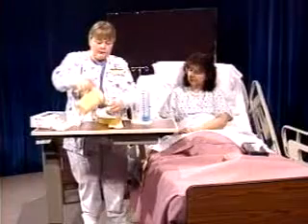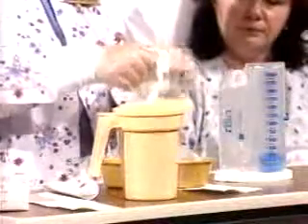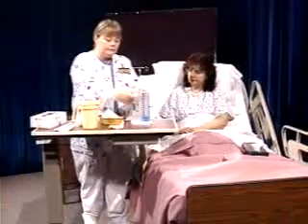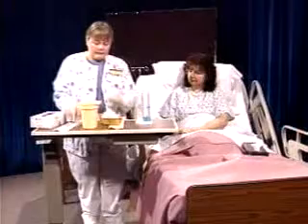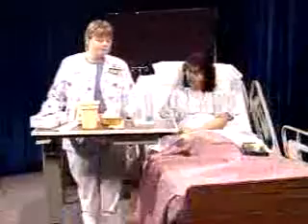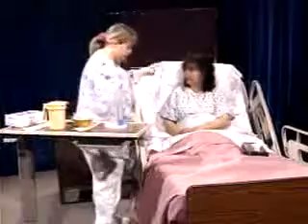Rinse the mouthpiece with water. Label the unit with the patient's name and store in a clean area with easy accessibility. The overbed table works well. Assist the patient to assume a more comfortable position and tidy the area.